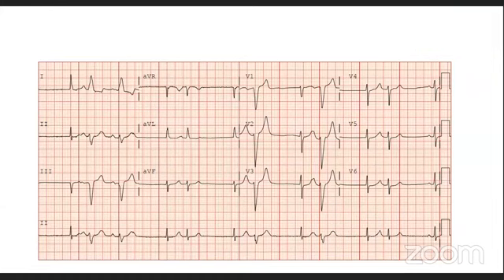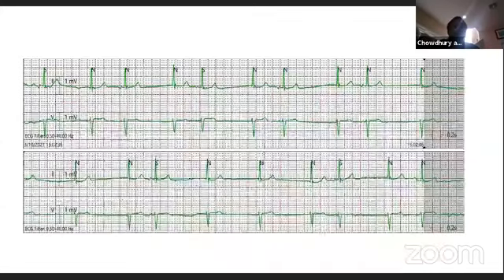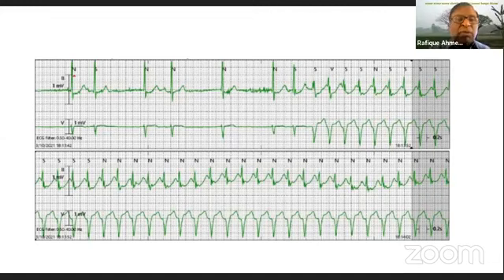Okay. Sir, this patient was admitted in the hospital and then went into this in the night. Yes. And now what? Yeah, so look at the first two beats. So there is a supraventricular bigeminy. And before the wide QRS, look, the first one is narrow, and then it goes into wide QRS. So the coupling interval is not shorter at all.